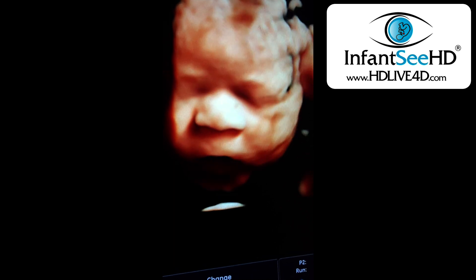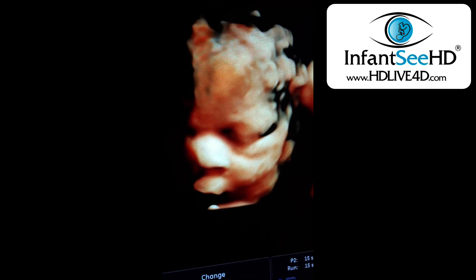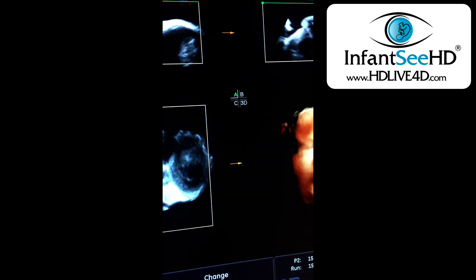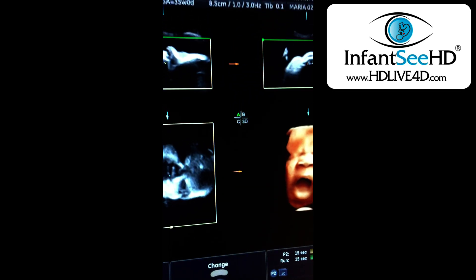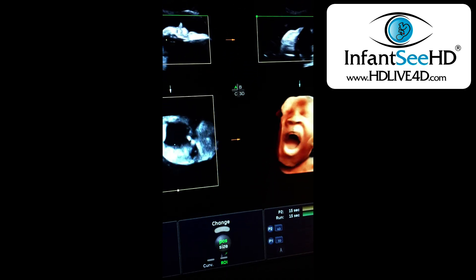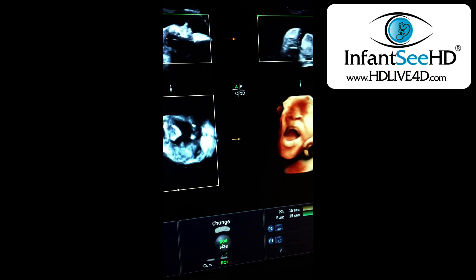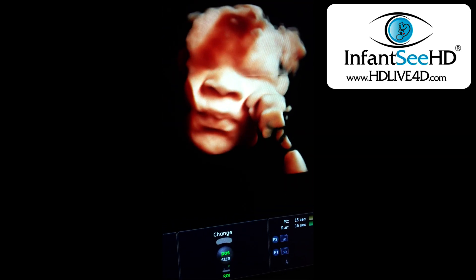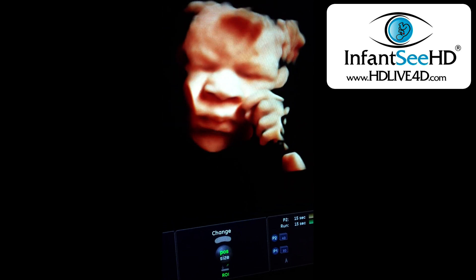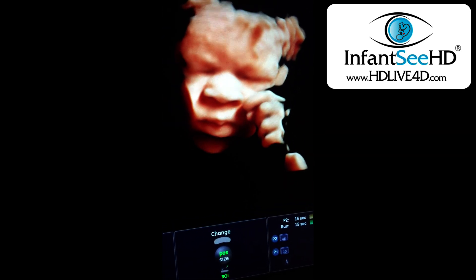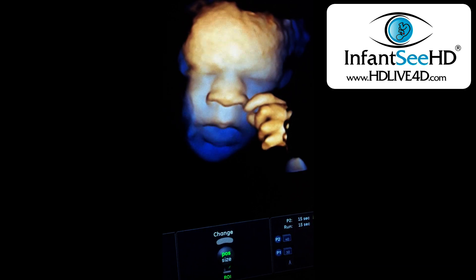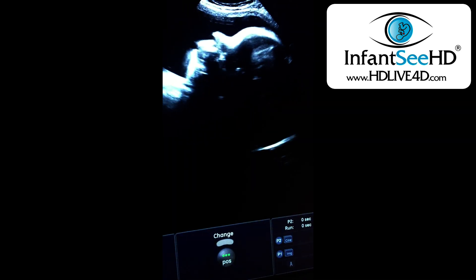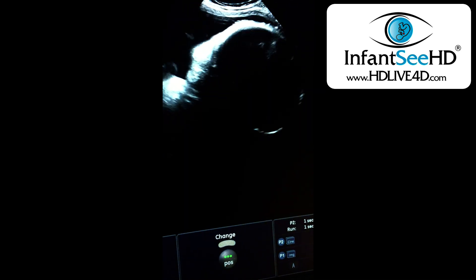So that was the difference between 2D, HD, and HD live technology — look at him yawning. So again, HD live, HD, and then back to 2D.